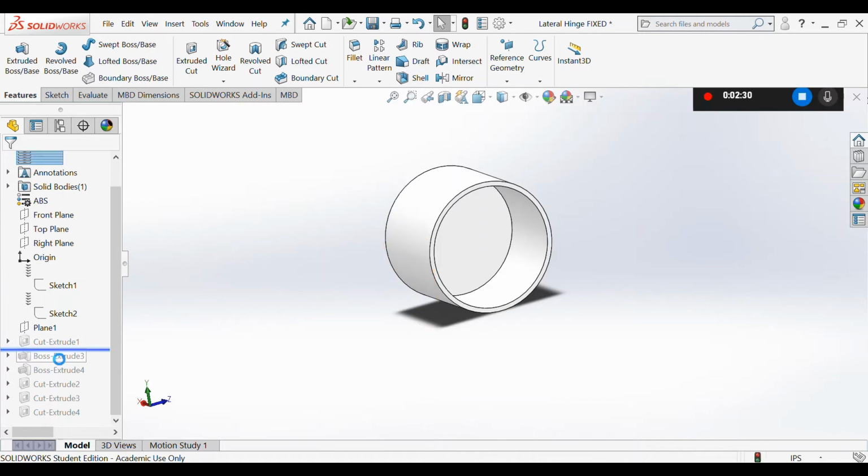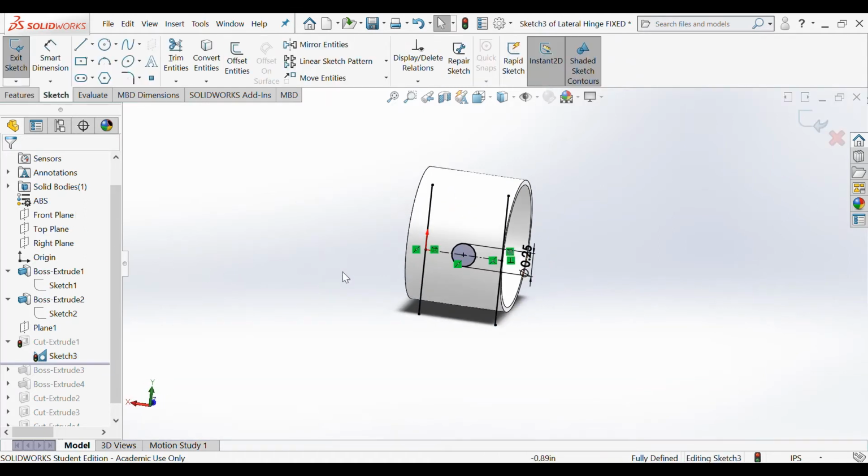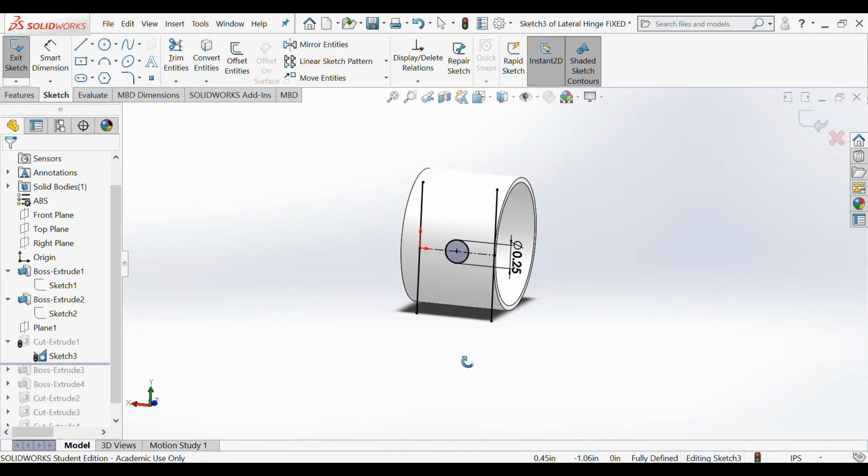Next, we create another sketch on top of that reference plane that we just made, and we create a circle in the middle outwards with a diameter of 0.25 inches. Now, the reason why we had to create this reference plane instead of just sketching directly on this cylindrical surface is because since this surface is curved, we actually are not allowed to sketch on it.